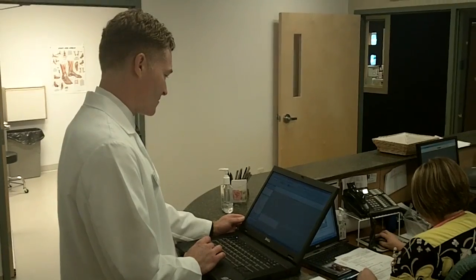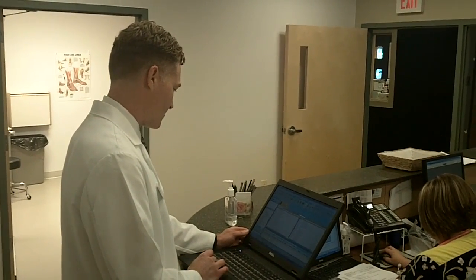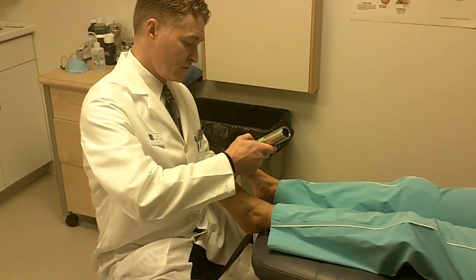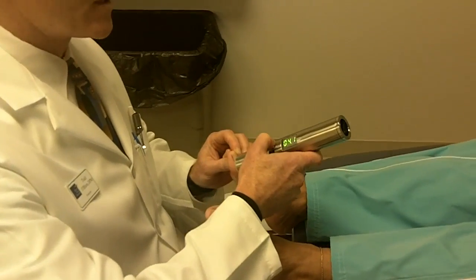The idea for doing this project was to make it more quantitative in that we can make a reproducible vibration with an electronic device versus having the old analog, so to speak, tuning fork. And when the vibrations go away, you can't feel it.